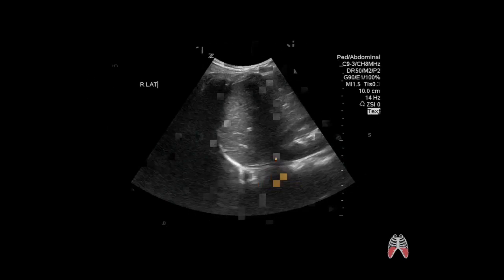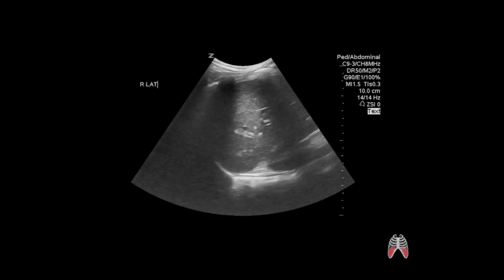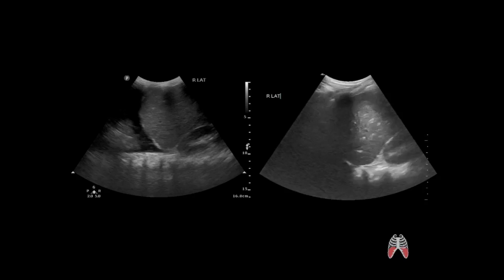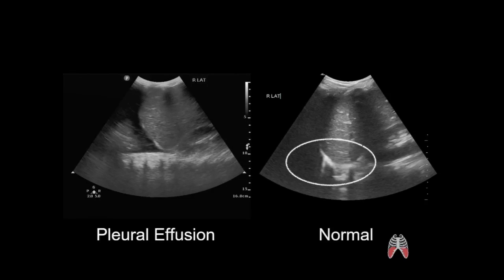So there's your effusion with the spine sign, excellent. Normal, just for those that are not as savvy, which I don't think anyone in this room is, the idea is that there is no spine sign here, and you're able to see your mirror imaging and not the spine sign. So this was a normal, and I just wanted, from an ultrasound education point of view, to point out the two sides, effusion and non-effusion, okay? That allows you to recognize a normal ultrasound, and that will help you as well.